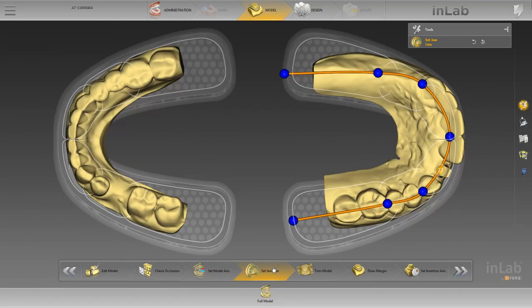In this phase we determine the model axis and then switch to the step set jawline. In this step we adjust the jawline displayed in orange with the help of the blue balls. The line should correspond with the main jawline, and the blue balls should be placed between anterior teeth and premolars, and premolars and molars. Then we move to the next step, draw margin.